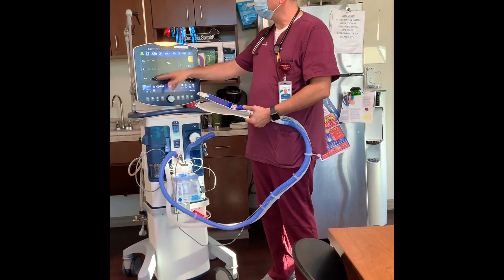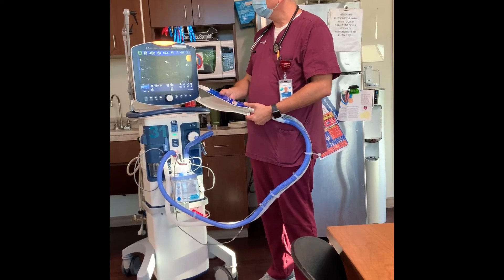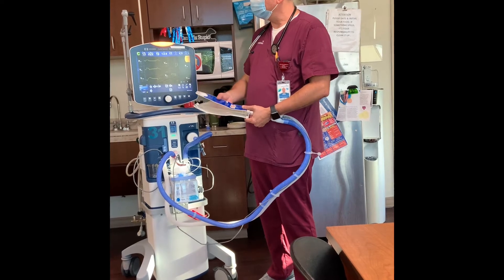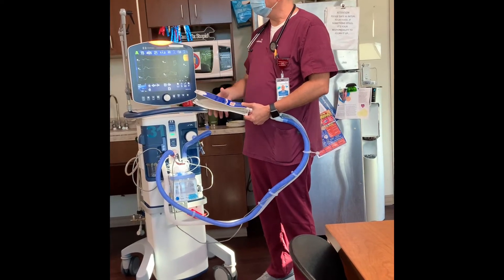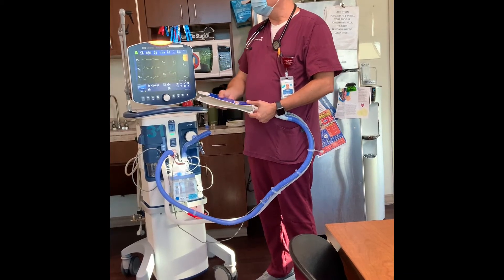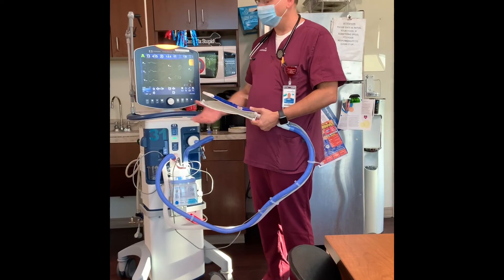It's set at 16 breaths a minute and they're breathing about 20 breaths a minute now. Every breath they take, whether it's one of the 16 scheduled ones or a breath they breathe over the set rate, they're getting 420 cc's of tidal volume pushed in.